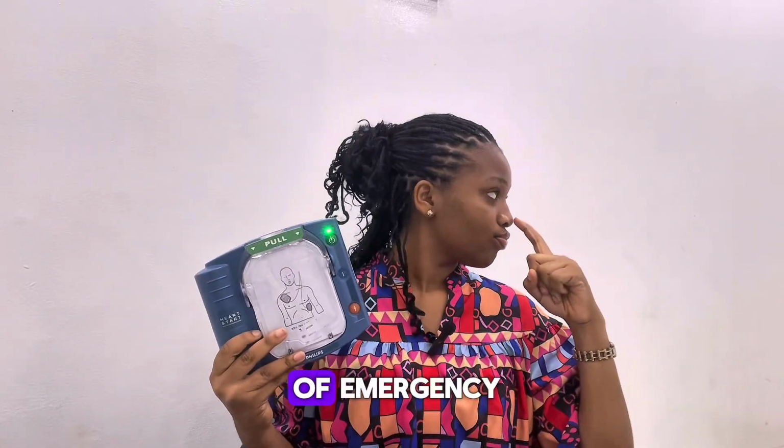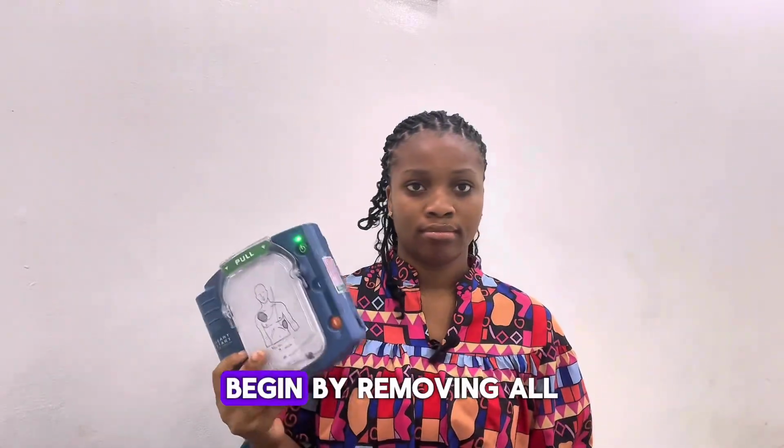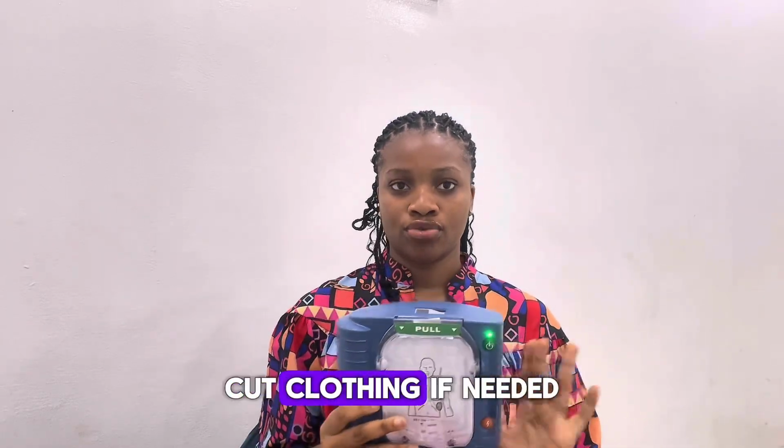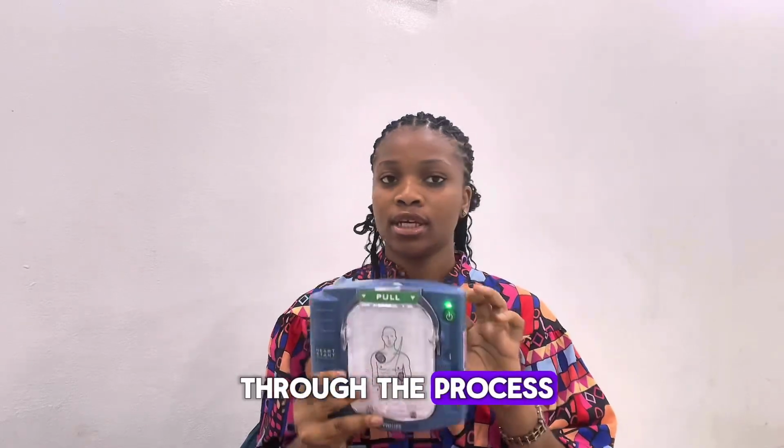Self-test. In case of emergency, press the green on-off button. Begin by removing all clothing from the patient's chest. Cut clothing if needed. We guide you throughout the process.